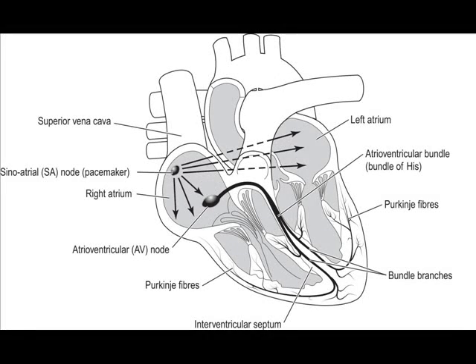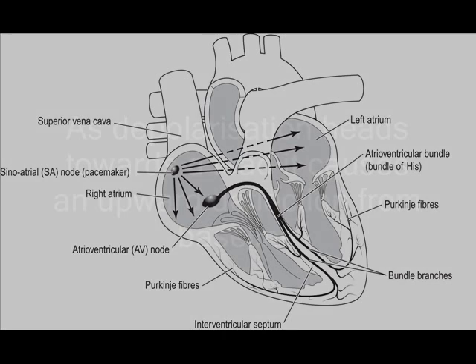This general direction of depolarization is known as the cardiac axis, and it spreads from the patient's top right, the sinus node, through the atrioventricular or AV node and down to the left ventricle, as this has a larger muscle mass than the right ventricle and extra wiring, for want of a better phrase. Of course, depolarization spreads all around the heart, but the general direction follows that pathway.